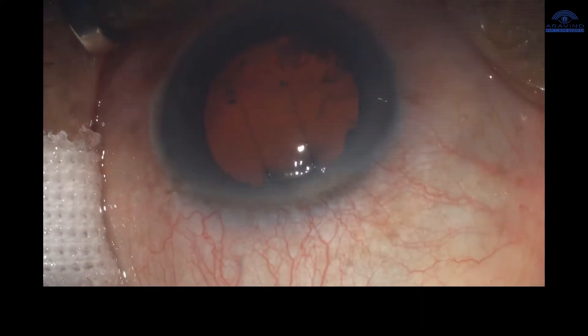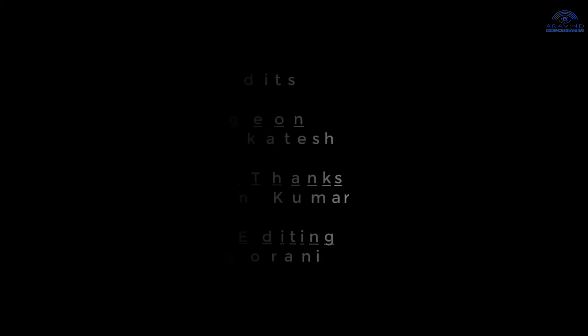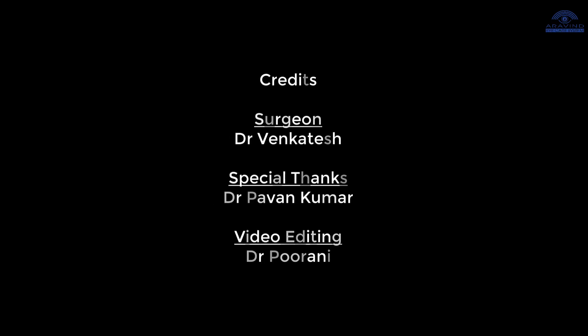This technique can reduce potential damage to the conjunctiva and reduces bleeding. The vector force achieved is more superior compared to that with superior rectus traction sutures.